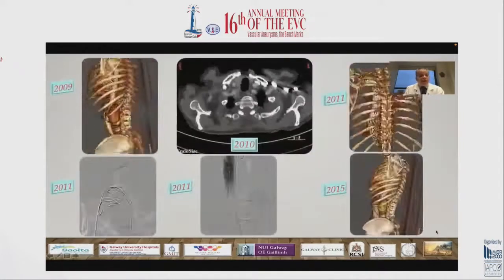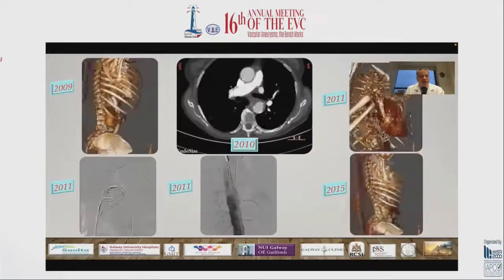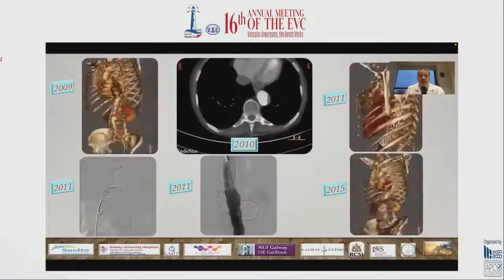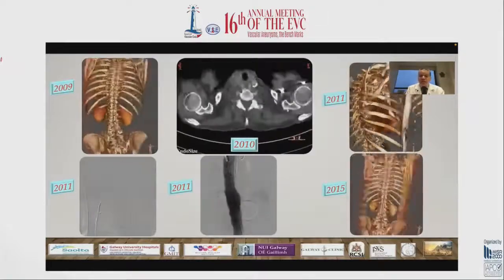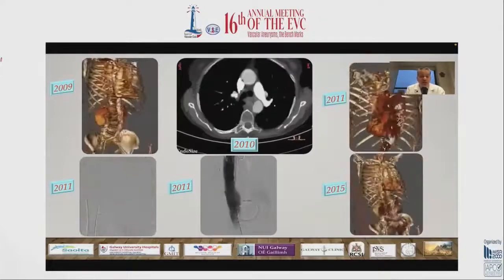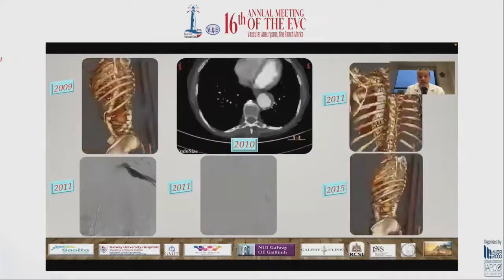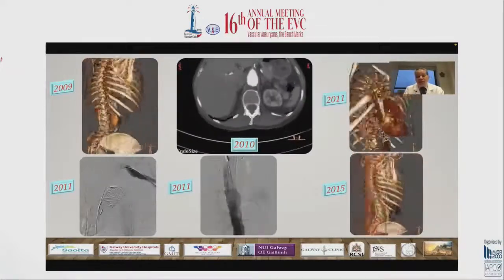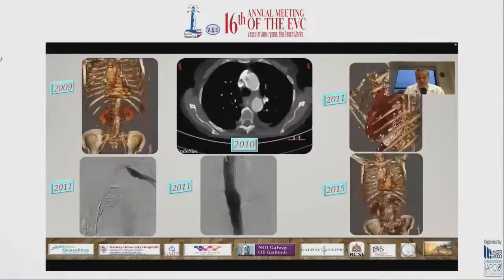So this is a patient who came to us in 2009 with a little bit of chest pain. We did a CT scan. We couldn't find anything. Wait a year. She came back with a thoracic aneurysm that was ruptured. So we put a TEVAR in for her. And as you can see here, we had to put a chimney to get a good seal. And this is the completion angio in 2011. There's nothing in the aorta. In 2015, she came with a ruptured infrarenal aortic aneurysm that required an emergency EVAR.